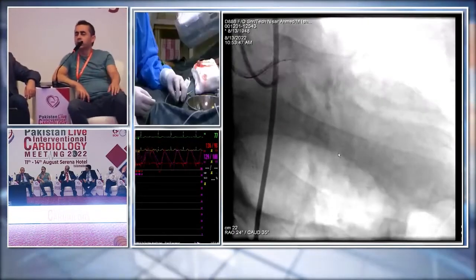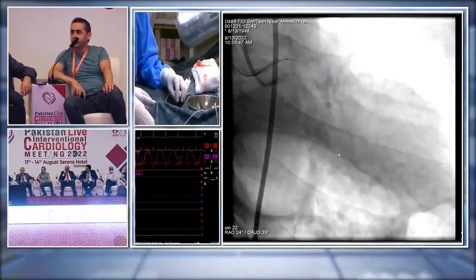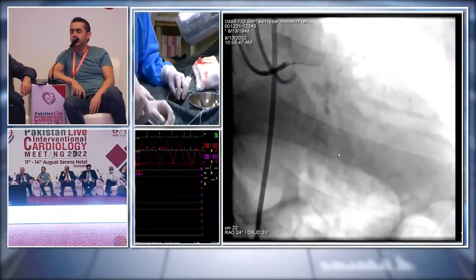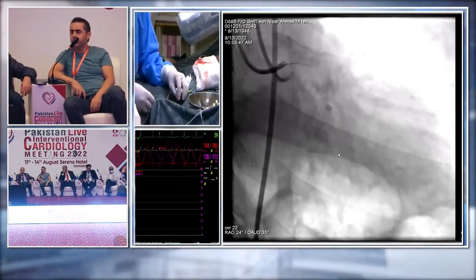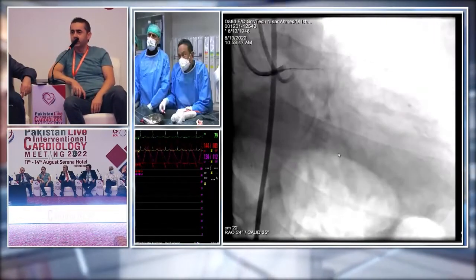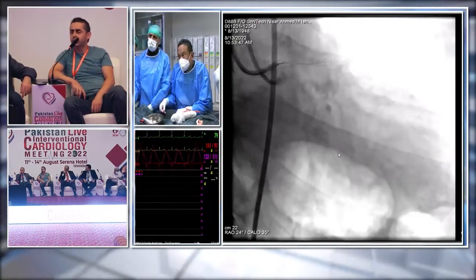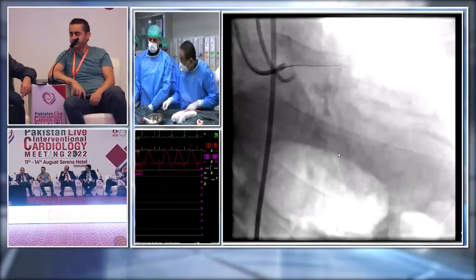You need an angled catheter, just for the left. For example, yeah, Super Cross just angled left catheter. Yes, also, if you have IVUS available, IVUS-guided penetration is reasonable for this patient. Maybe if it is a hard penetration, a dual lumen catheter is also another option.